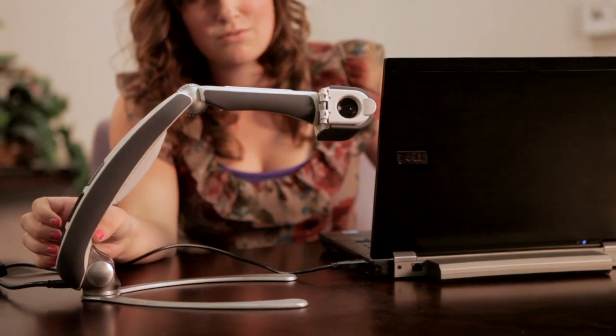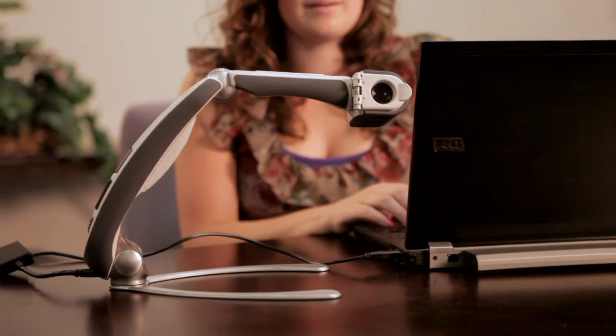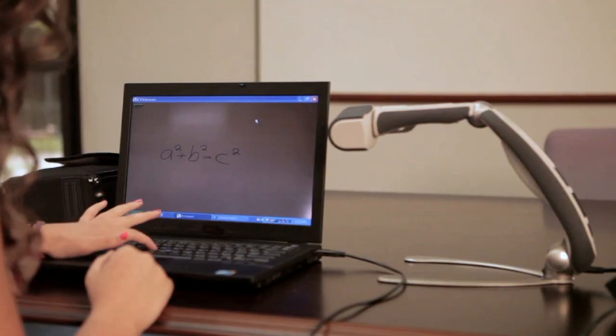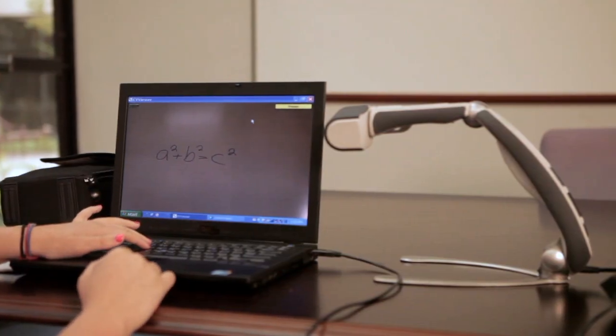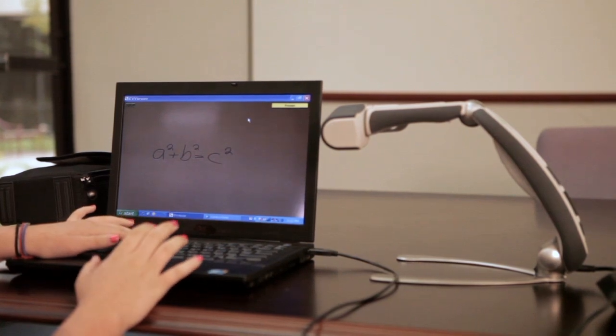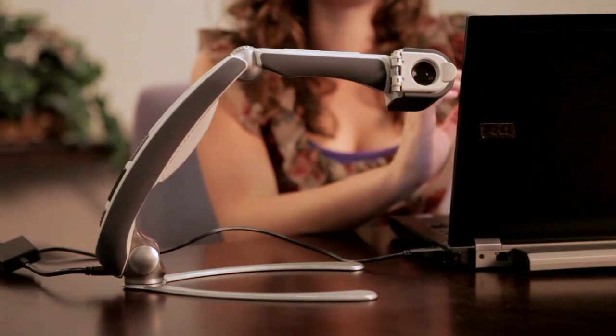You can do it along the panel, along the Transformer, or on my laptop keyboard. You can freeze the frame by just pressing F. So if the teacher is writing too fast, I can just freeze it and then take down my notes.